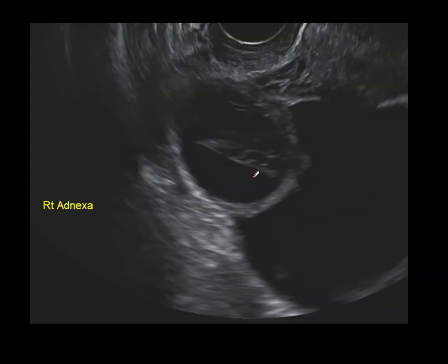One thing I'd like to emphasize about this cyst, which is very useful if you can find it, you can see this perfectly straight border in the clot here. It would be very unusual for a cancer to have this appearance. And sometimes you can see that the clot, which is what makes up the internal contents of the cyst, has become retracted or pulled back from the edges and has a concave internal appearance.